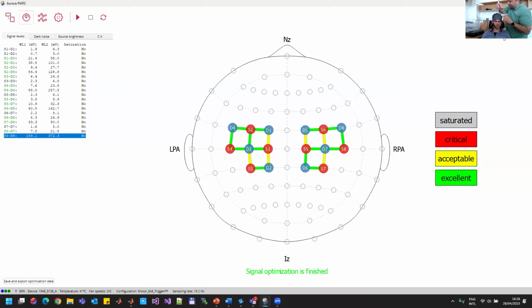Yeah, this procedure takes a couple of minutes, 2 or 3 usually. I think Frankie also mentioned earlier that you have all the electrodes. Usually you have to start filling the electrodes with gel from left to right, because they are also numbered like this, 1, 2, 3, 4, starting from left to right, from the first row to the last one. Okay.